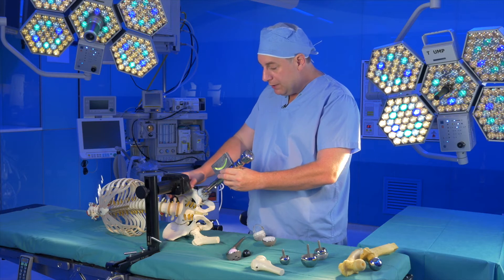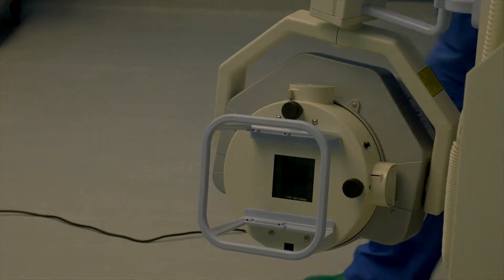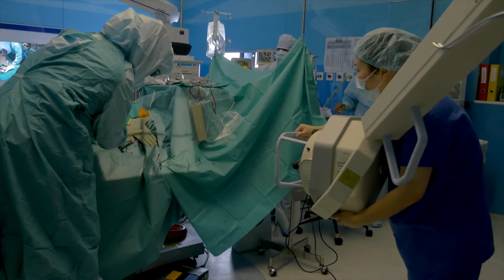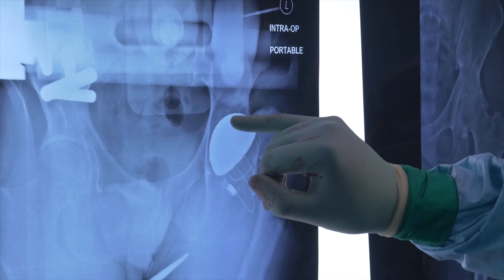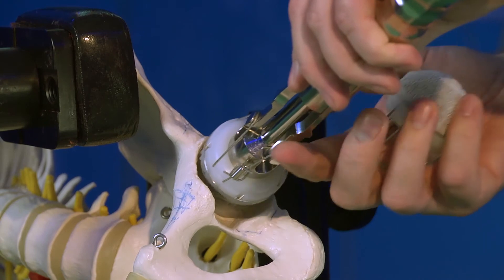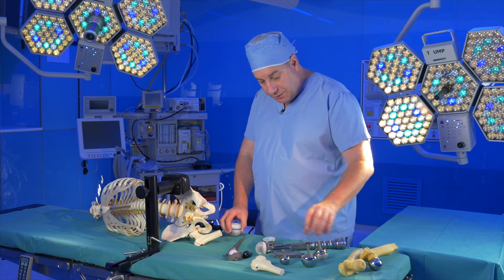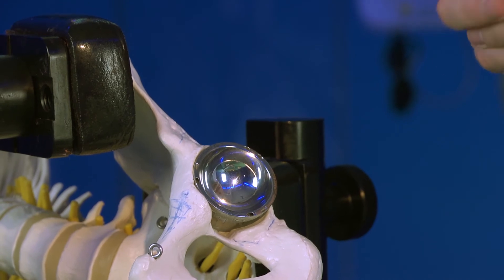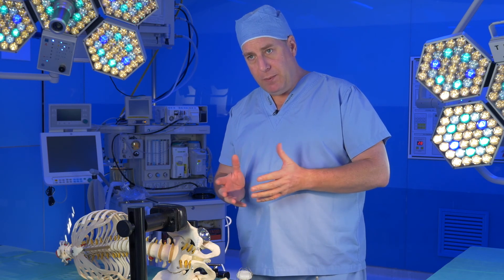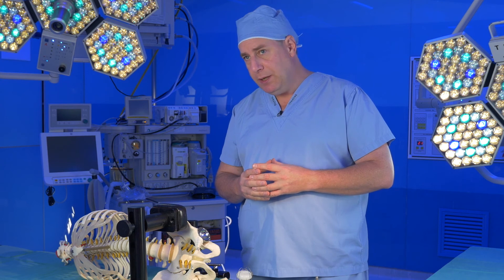The problem is that, despite the positioning devices, the patient's pelvis can move and introduce error. The technique we use to try and prevent that is to place the cup and then take an x-ray. We can then measure the x-ray during the operation, and if the cup needs to be readjusted, we simply reattach the cup introducer and reposition it. If the cup is in the right position, we cut the wires attaching the cup introducer and we're left with our accurately positioned cup. We've measured 100 consecutive cups placed in this way and seen that we've managed to put all the cups in the right place, and this is being published so that other surgeons might consider using that technique.